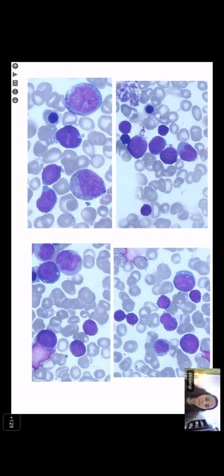What about these cells? One, two, three. What do you think? Shivangi, I think I'm losing you in between. Is it only me or is her voice breaking in between? Yes, sir. Her voice looks like it's breaking. Sir, am I audible? We lost you in between, Shivangi. Am I audible now? Yes. So much better. What do you think about these three cells, sir? They look like lymphoid lineage cells only, so blast.